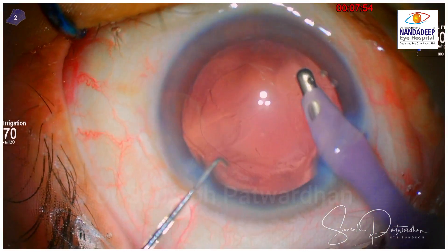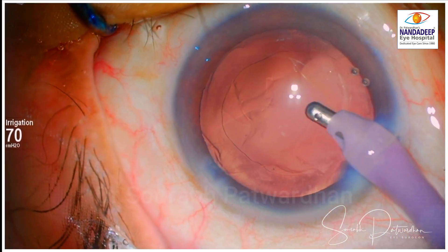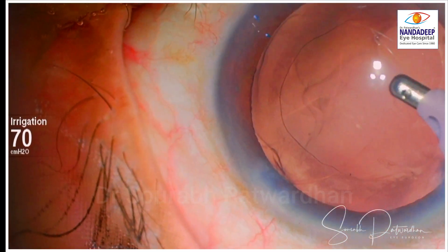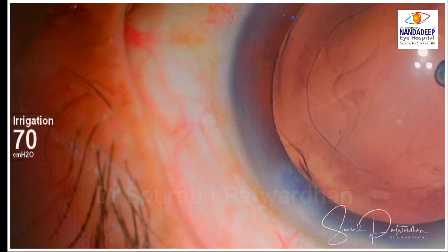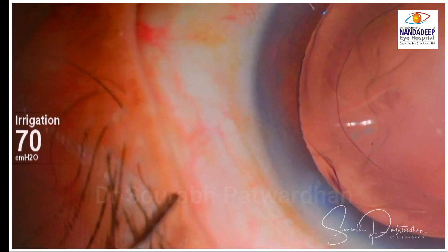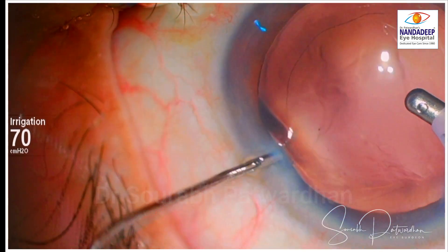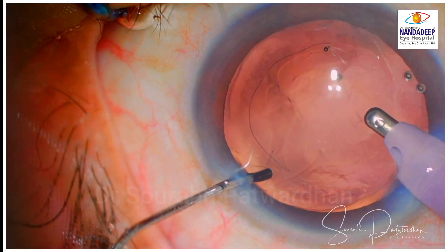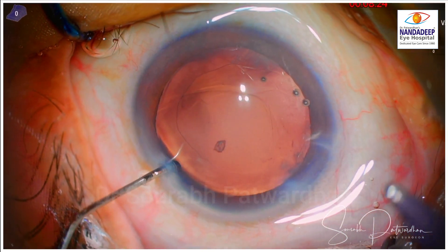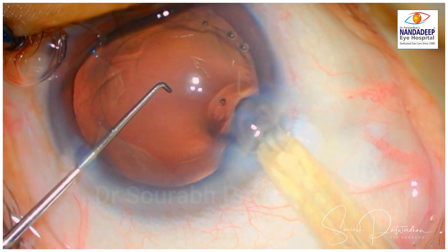As you can see, you can easily remove the cortex. The bottle height I have kept at 70 cm. Around 60 to 70 cm of bottle height is what I recommend for cases where you don't want the anterior hyaloid to be ruptured. Always keep low vacuum parameters according to the bottle height. Again, OVD-BSS exchange always.